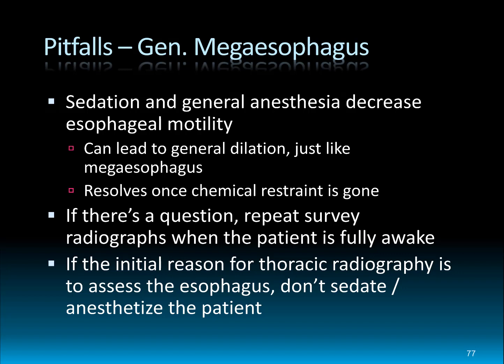And then, like I've said before, the one main area to be careful about is in a patient who's recently sedated or anesthetized. The esophagus doesn't always, but certainly can dilate and might lead to a misdiagnosis of megaesophagus. So in a patient who you've sedated or anesthetized recently, if there's any question, let the dog wake up for a few more hours, re-radiograph that thorax and see if the esophagus is still dilated, in which case you need to be more concerned, or if that has gone back to normal, in which case it was just a result of your anesthesia or sedation.